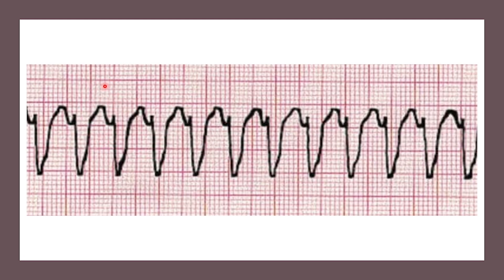This is VTAC. One thing to note is this can be VTAC with or without a pulse. Depending on the patient's presentation, if they have a pulse with a VTAC rhythm, we may want to consider an antidysrhythmic drug or synchronized cardioversion — you always want to synchronize before you cardiovert. If they don't have a pulse, we start CPR. This is one of our shockable rhythms; we can administer epinephrine and defibrillate at 360 joules or 200 joules depending on monophasic or biphasic, per your protocols. It's very important to distinguish whether the patient has a pulse or not.